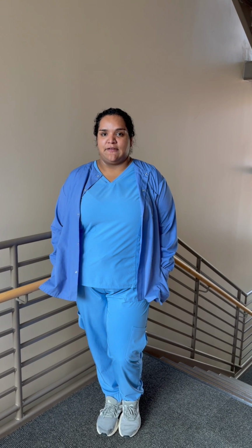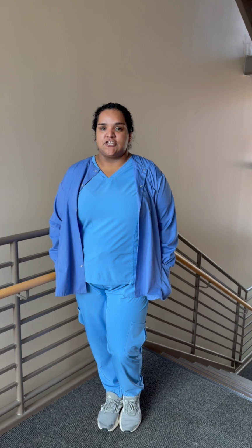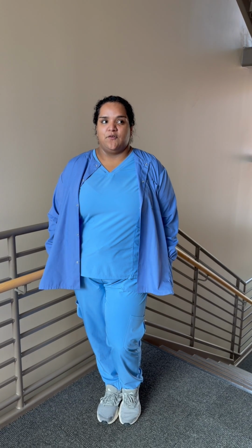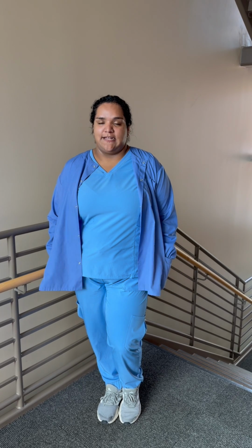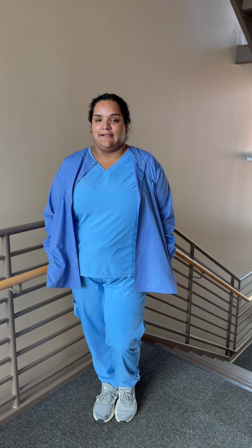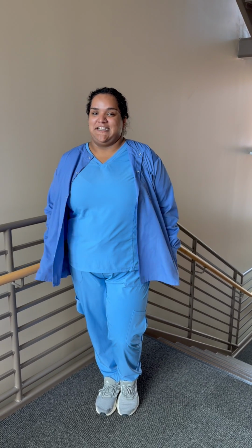Pre-operatively, I will be setting up for the surgery, maintaining the sterile field, making sure there's no contamination, and then I will orient the sterile field to the patient, making sure it's away from traffic. Intraoperatively I'll be passing instruments and maintaining the sterile field. Before we start the surgery, I'll do a count, and after the surgery, before the surgeon closes the patient, I'll do another count, and that's pretty much it.